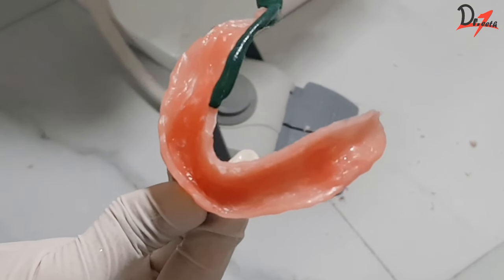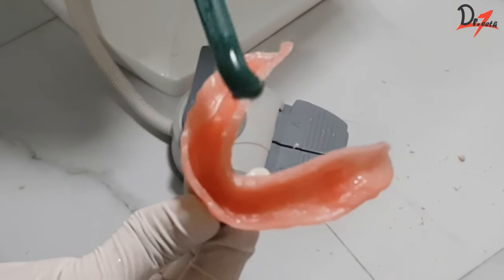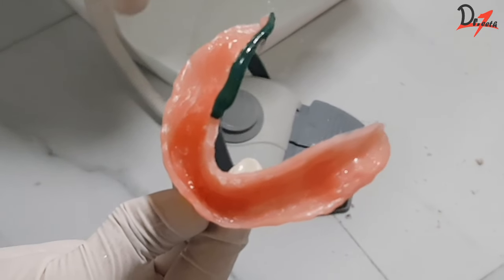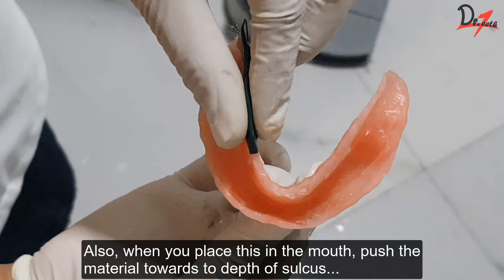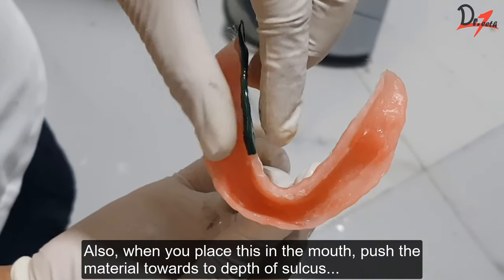I'm going to heat up the green stick and apply a layer. Sometimes the green stick won't stick on the tray because it is wet, so make sure that your borders are completely dry before you apply the green stick. After that, I'll use petroleum jelly on my fingers and build up the material — I'll build up the flange with my hands. This is very important.